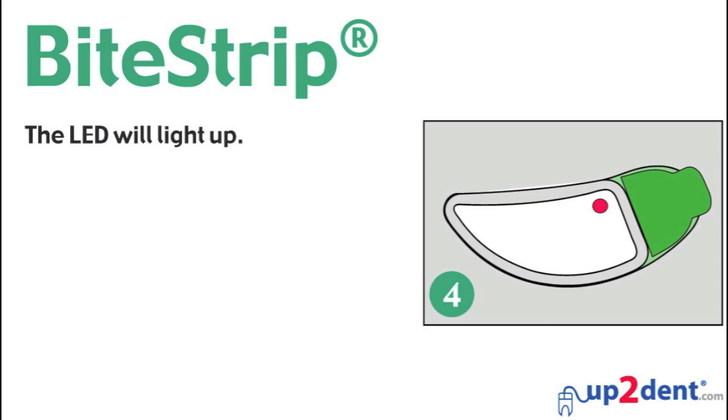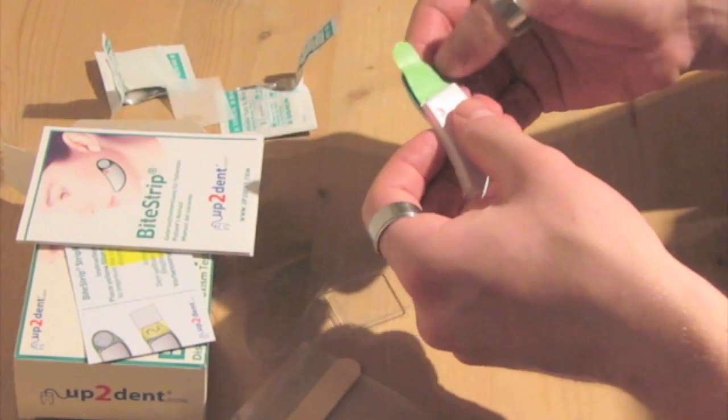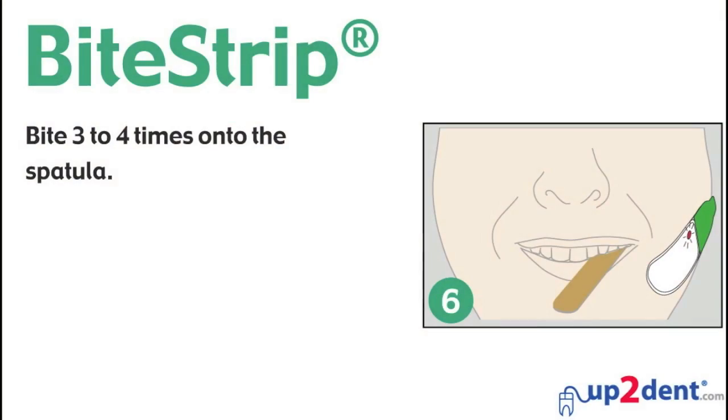The LED will light up. Apply the Bite Strip to the skin over the masseter muscle. Bite 3 to 4 times onto the spatula.